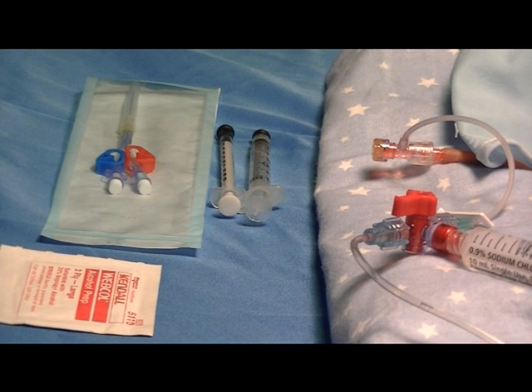This will be a demonstration of the Humi Microdraw blood transfer device for an arterial blood sample from an umbilical artery catheter using aspirating syringes.